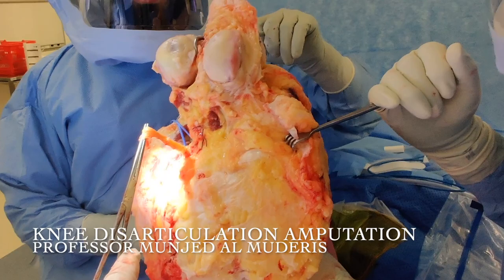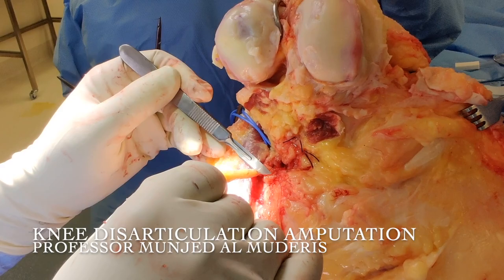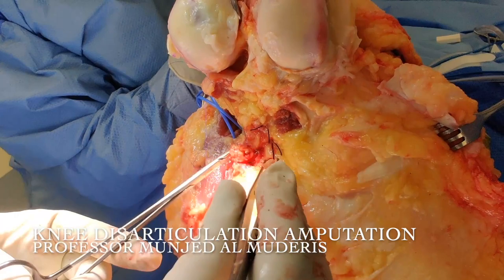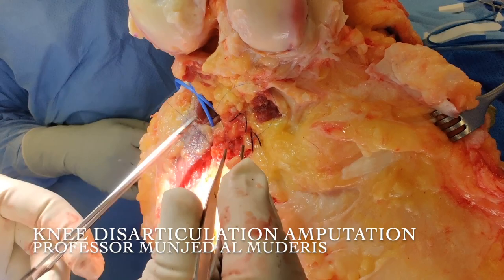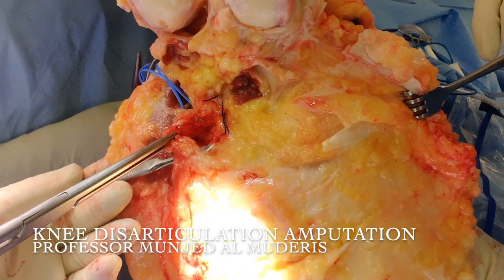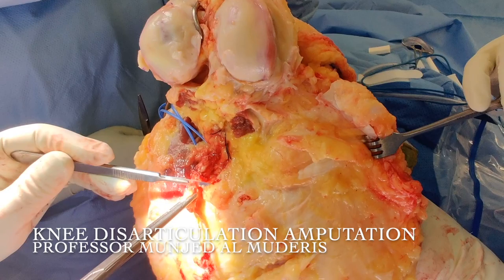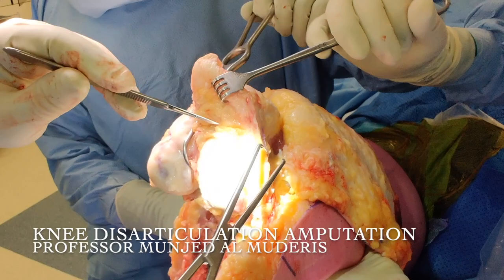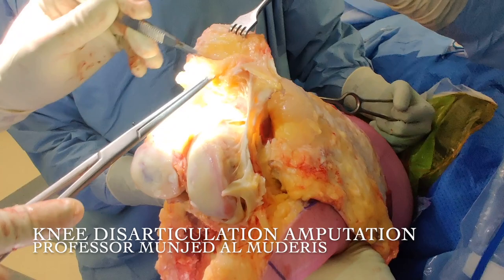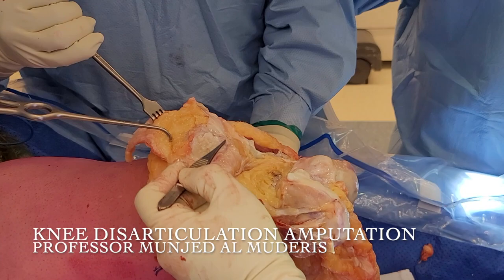Now that I've ligated the vessels, I attend to the nerves and perform targeted muscle reinnervation. We've done the nerve. The condyles with a knee disarticulation are very bulky, so try to debulk the condyles in order to provide optimum fit for a traditional socket-mounted prosthesis. Try to maximize his chances by providing him with a load-bearing end.